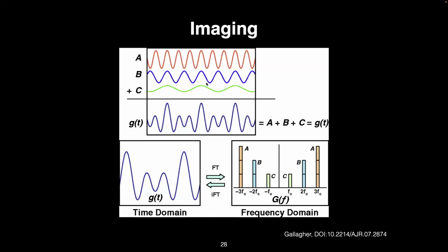When you have these different frequencies adding up, you get a waveform that looks something like this. And if you actually look at the raw MR signal you're getting in an RF coil, it's not going to look too different from this. You're going to see these oscillations back and forth.